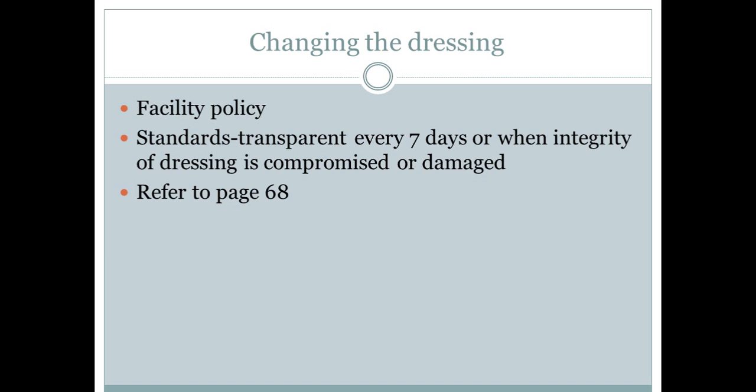If you don't detect any complications, hold the catheter at the hub and carefully clean around the site with an alcohol swab or other approved solution, working in a swiping motion to avoid introducing pathogens into the clean area. Again, we're letting the area dry on its own. If you put the Tegaderm on before the skin is dry, that Tegaderm is just going to slide right off. And then after you put that tape on, re-secure the device. If you have a StatLock device, put that on, or use tape according to what your facility policy is.